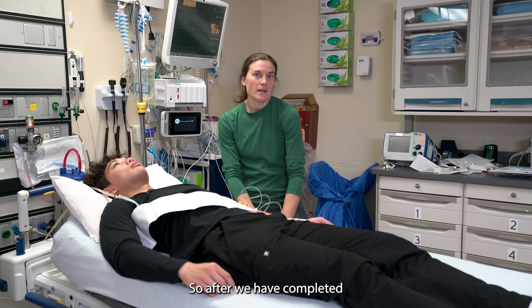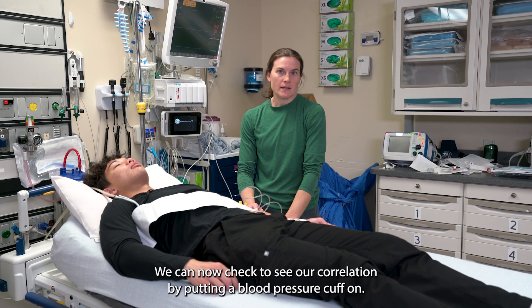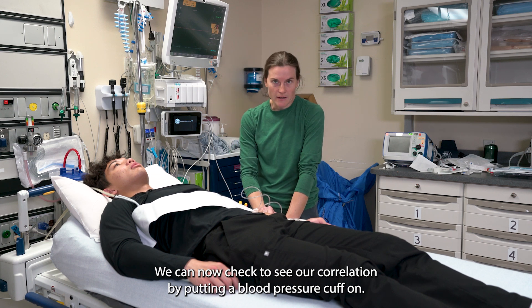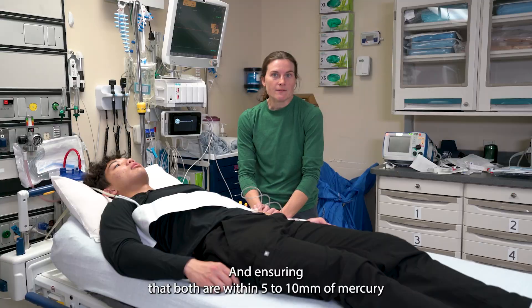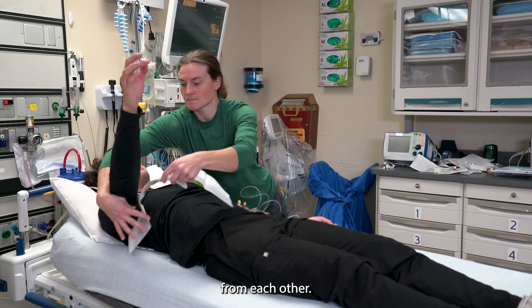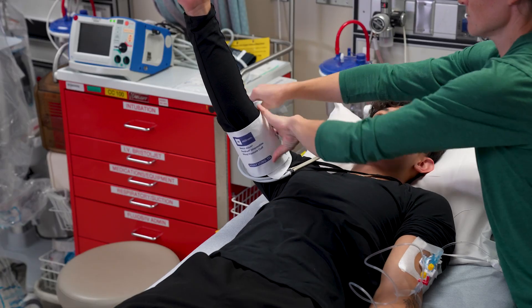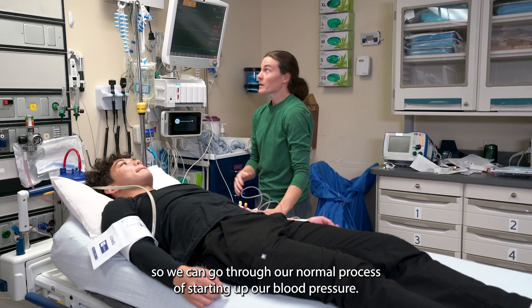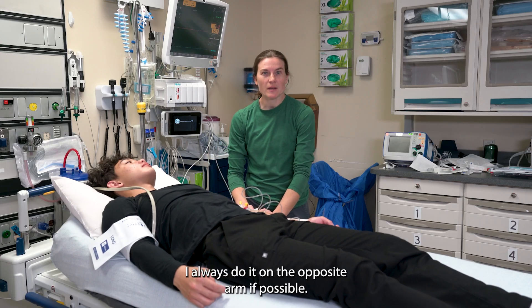After we have completed our art line setup and have it zeroed, we can now check to see our correlation by putting a blood pressure cuff on and ensuring that both are within five to ten millimeters of mercury from each other. Always do it on the opposite arm if possible.